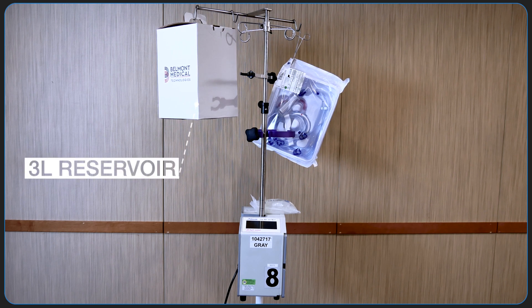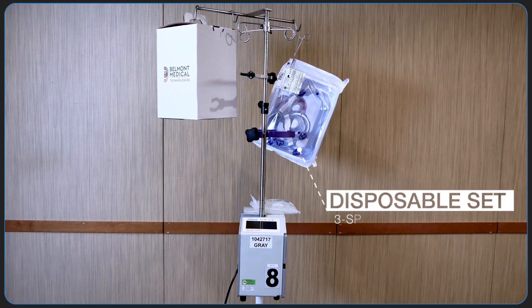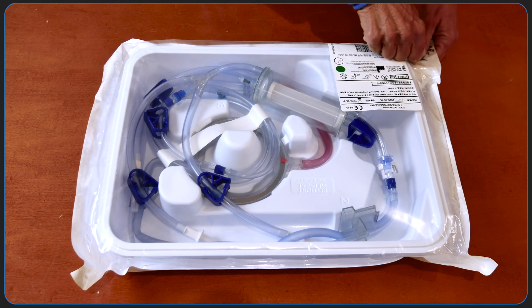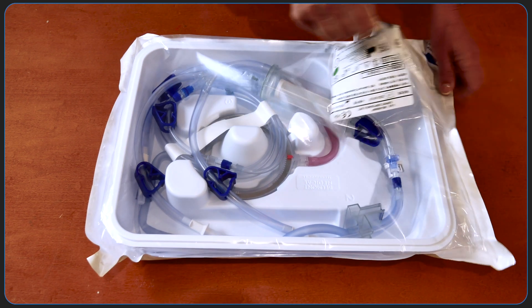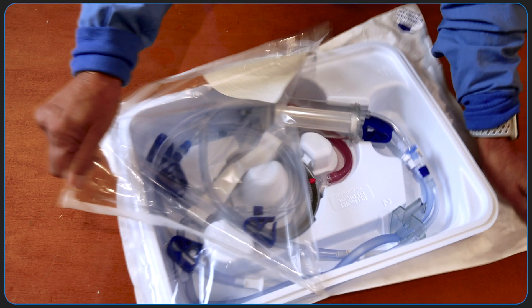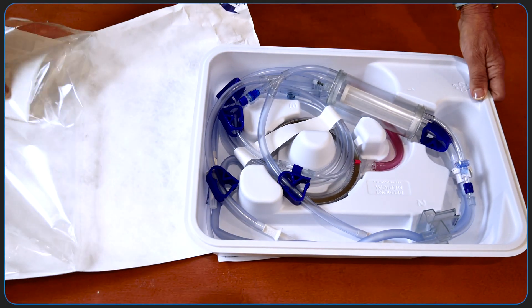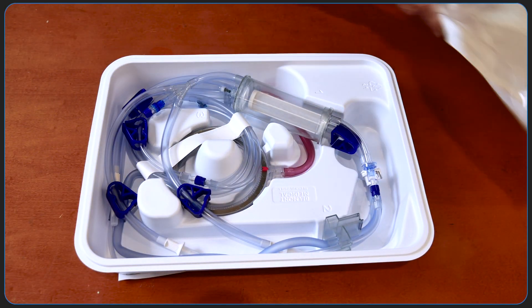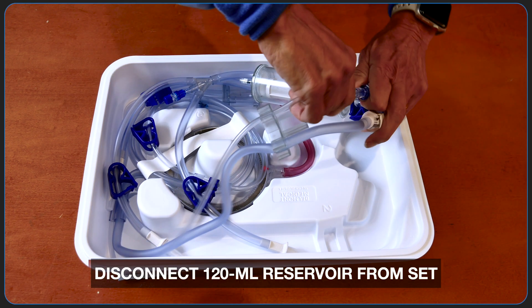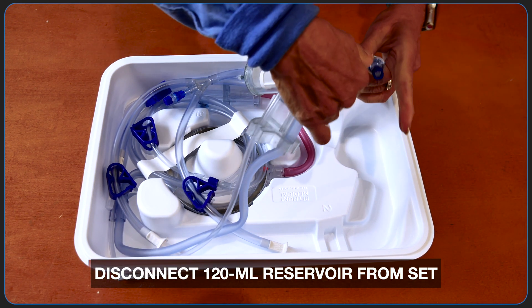Also attached to the IV pole is a disposable 3L large volume reservoir and a 3-spike disposable set. We're going to first open the 3-spike disposable set. You can operate the Belmont at the full range of flow rates with this set. Included with the set is a smaller reservoir that's 120cc, which we'll disconnect here by twisting the lower fittings.